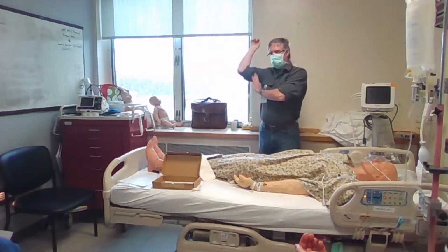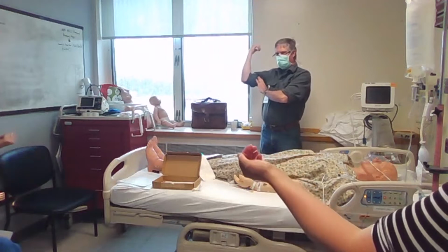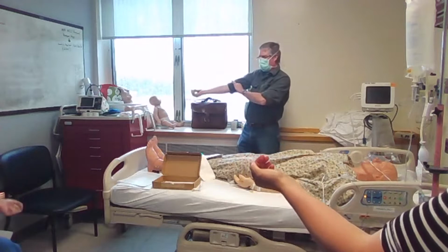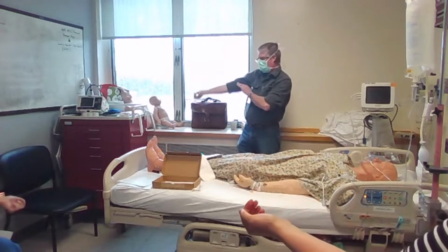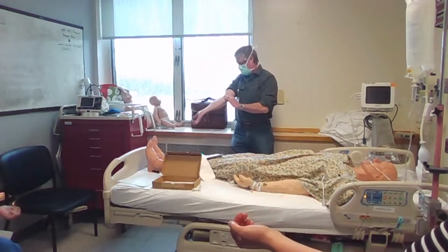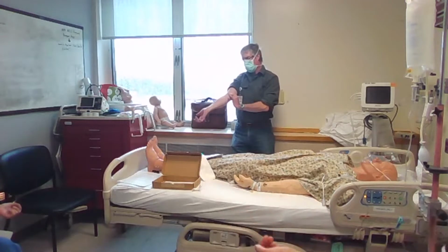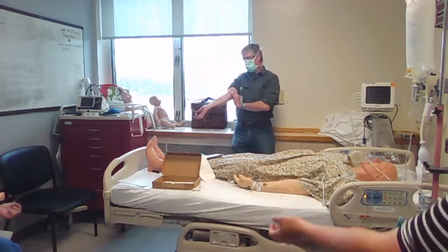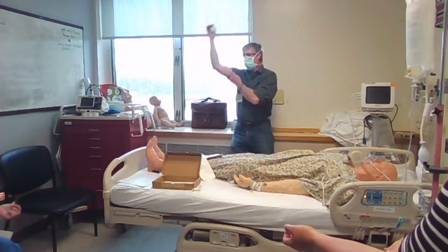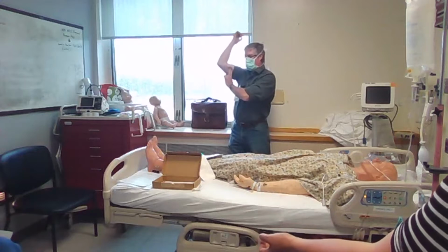brachial, which you find between your brachialis and your biceps muscle. And there's a groove there. You can find it lower, kind of up in here, but then it could be harder. So depending on the person, that's actually a really good thing that you do. On some really big people, sometimes this is going to be the most superficial place that you can get the brachial artery. But if you feel there, you can sometimes feel it, but it's way down in a groove, kind of underneath the muscle. The other place is right between your brachialis and your bicep muscle. There's a groove in your arm.